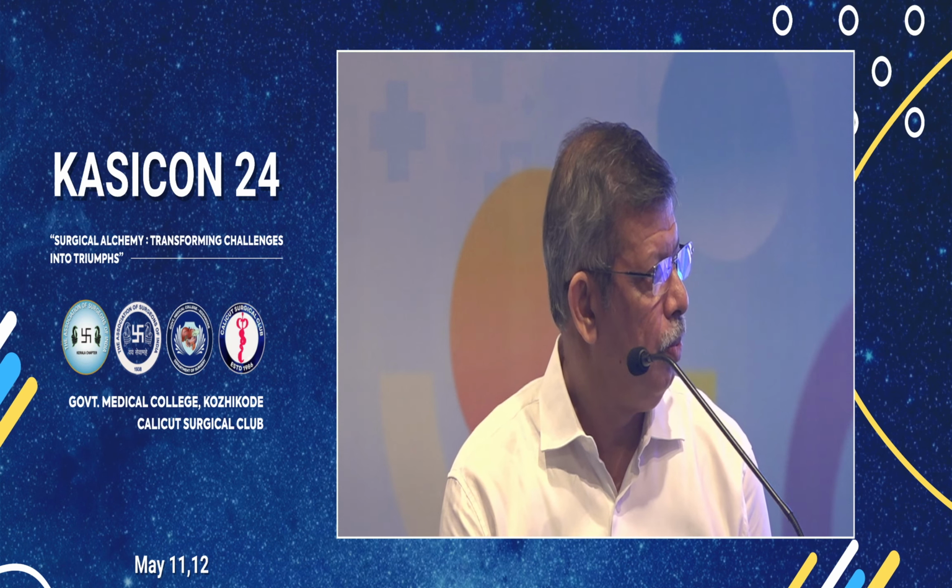Sir, what about using VisiPort to avoid such injuries? Yeah, actually I had a video, but I had not shown that. The VisiPort is also very good, and you can go layer by layer, and you know when you are entering into the abdomen. Even E-TEP also, now people are using VisiPort. In E-TEP, you have to enter between the rectus muscle and the posterior rectus sheath.